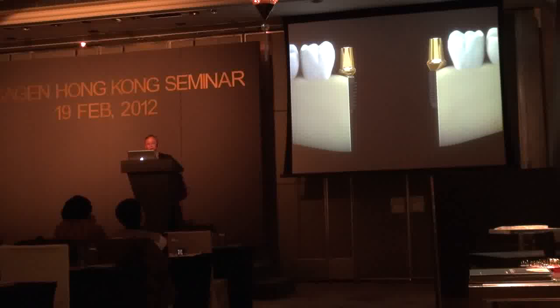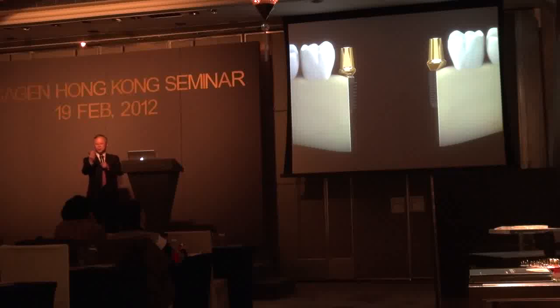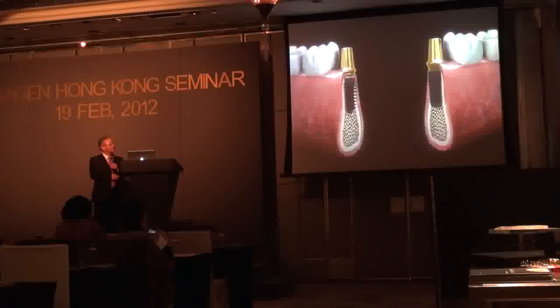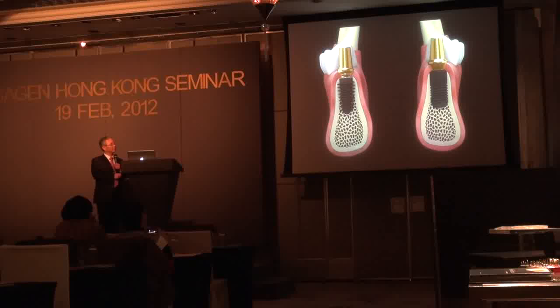And this is a distal view of the implant on the X-ray. On the X-ray we can see only the mesial and distal sides, not the buccal and lingual sides. So if you look at the buccal and lingual sides, it can be different.